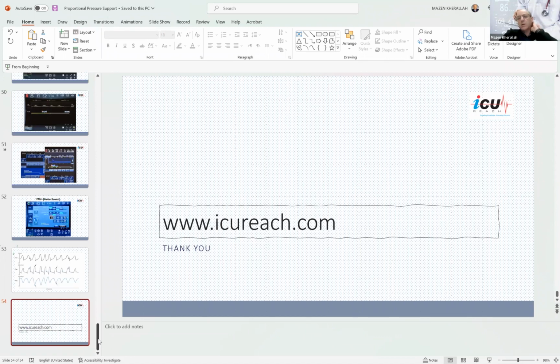Yeah, very good, Faisal. Thank you. So first question, how to monitor the flow assist is the rise in the flow. If you have a very high rise in the flow, you don't want that. You want to have a smooth increase in the flow, similar to the spontaneous breath. So again, this mode is very close to our spontaneous breath, and that's the purpose of it. It should be triggered by the patient, and then we should go up slowly in the flow, similar to the way we breathe. We increase the flow slowly, and that's what you want to see.